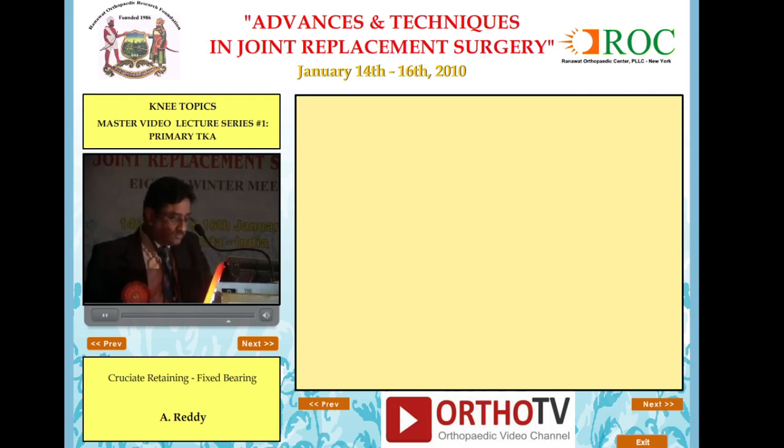Forward. Yeah. Cruciate, I have not touched the cruciate at all. Still cruciate is there. Forward. That is the posterior cruciate. Forward. The only thing is you should have a special bifid retractor, which I will show you. That is the one. That is a bifid retractor which has got 2 prongs which will go on either side of the PCL. And now when you cut the bone, the saw should not go right in the middle part to the posterior aspect.